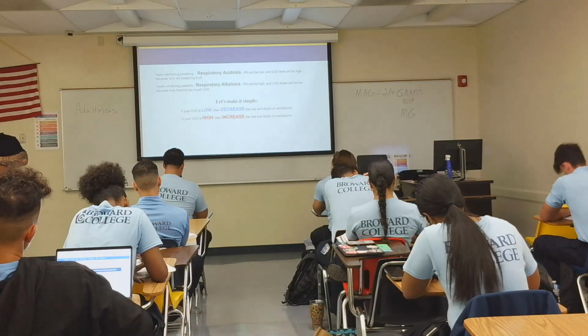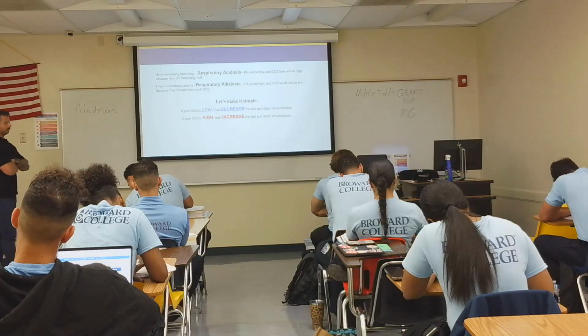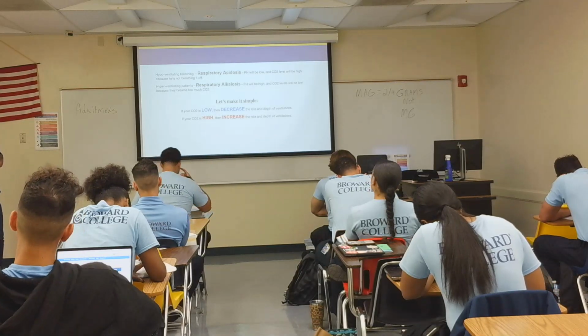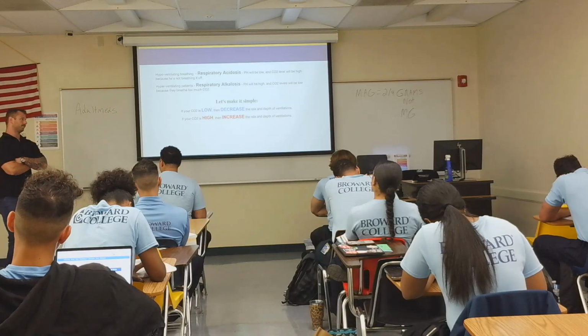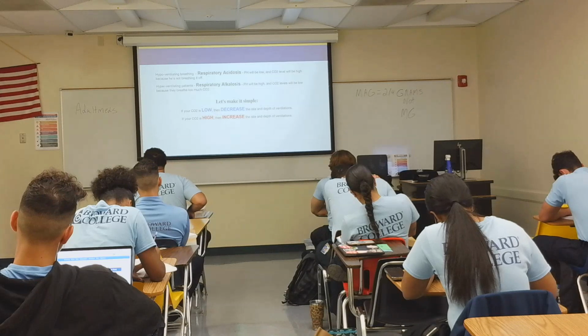It's a good marker for sure. If I'm having a real cardiac event, my SpO2 is not always going to be great. It should be low. Still, I'd do a 12-lead no matter what, whether it's pediatric or not.